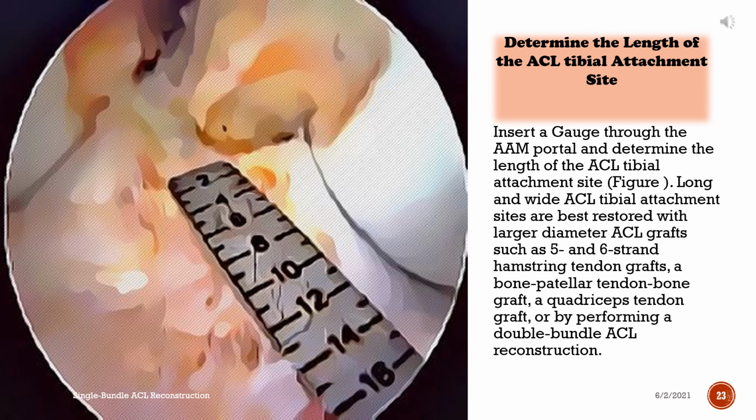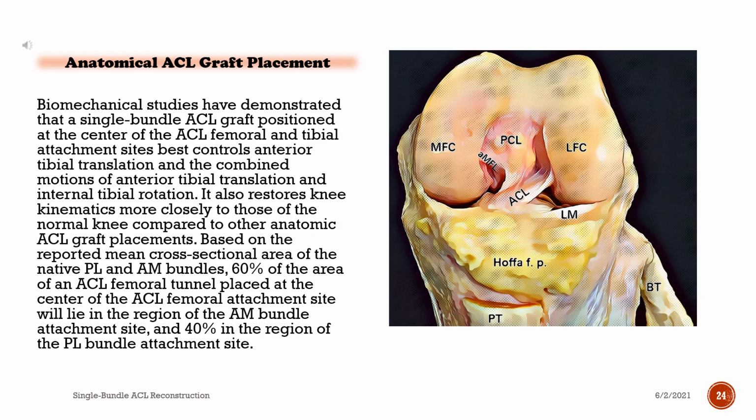Determine the length of the ACL tibial attachment site. Insert a gauge through the AM portal and determine the length of the ACL tibial attachment site. Figure. Long and wide ACL tibial attachment sites are best restored with larger diameter ACL grafts such as 5 and 6 strand hamstring tendon grafts, a bone-patellar tendon-bone graft, a quadriceps tendon graft, or by performing a double bundle ACL reconstruction. Anatomical ACL graft placement.